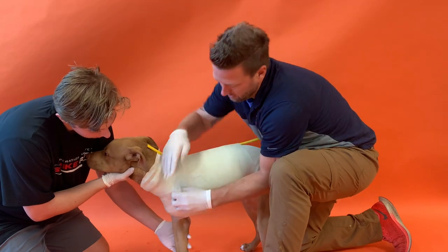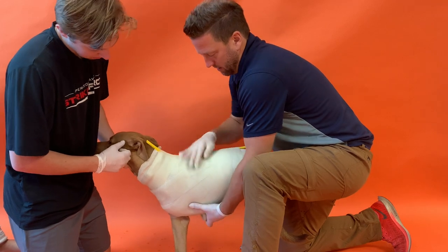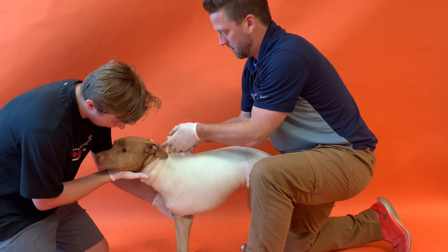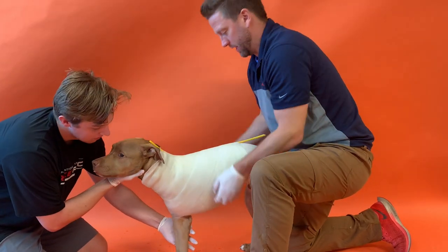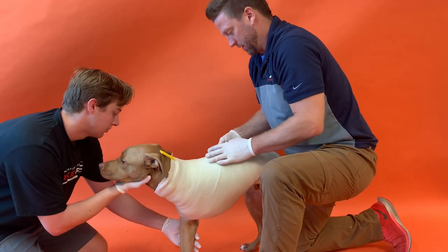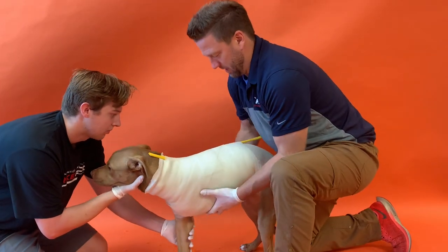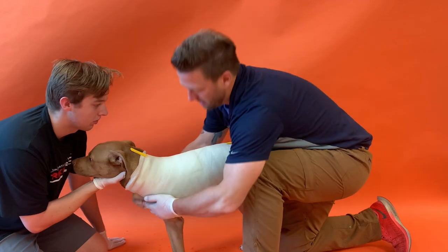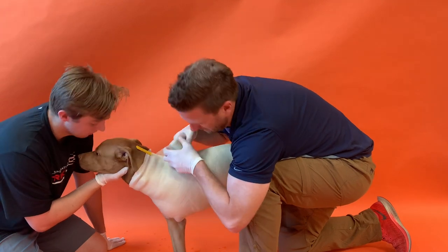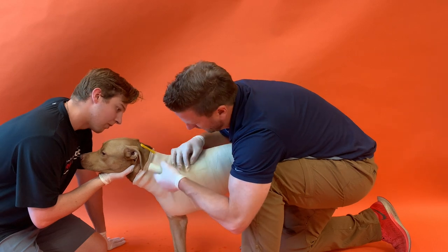On roll three, cross over and go around the neck a little, making sure we get the amputation site. I'll do a figure eight here. This is my fourth roll on a 50-pound dog — sometimes you need a few more. I'll probably do one more roll, so that's five rolls total on a 50-pound dog. Cover as much surface area as you can while allowing the good leg to protrude through the cast.